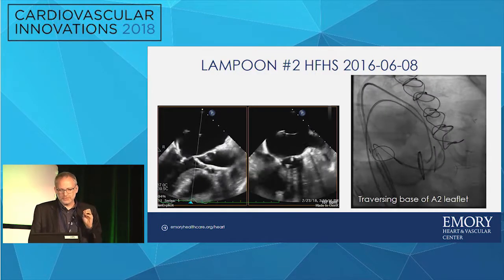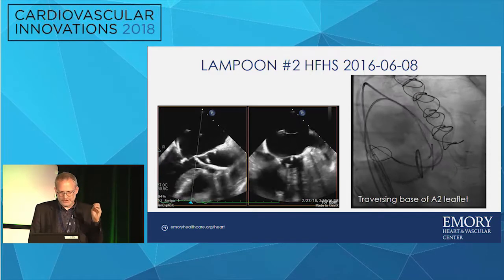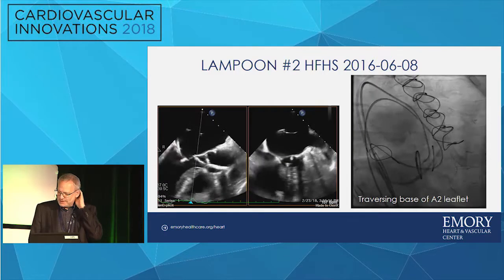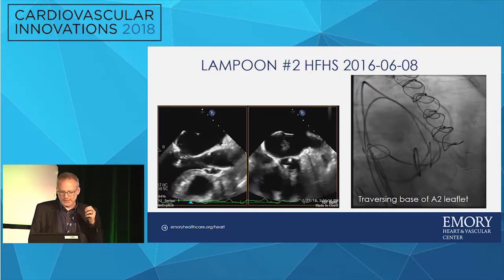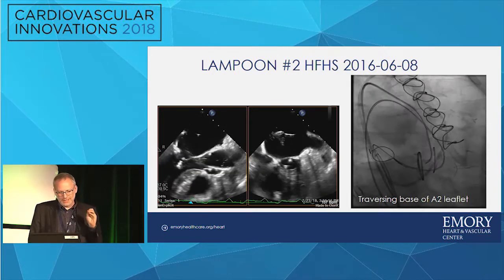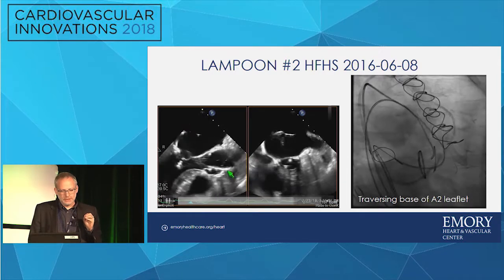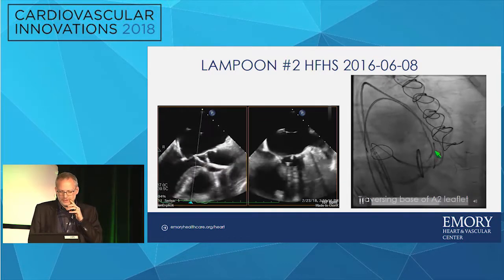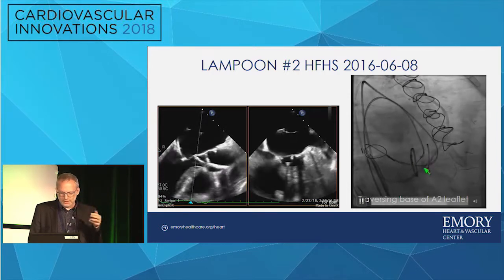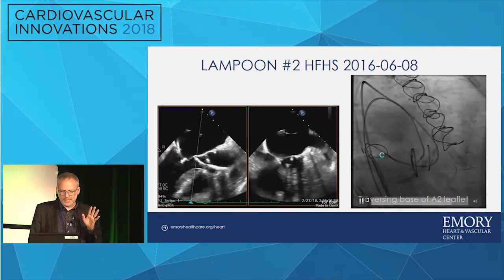So here's the very first case done. I flew down to Emory and my good friend Vasilis, now my partner, and we did the very first one in May of 2016. A couple of days later, my patient was lined up and we came back to Ford. This is the very first case I did at Ford, number two in the world. Here's what it looks like. You just need the LVOT view, and you electrify and burn through. You'll see bubbles in the left atrium. This happened to be a patient with a ring, which is great because you get good landmarks. It doesn't even matter where the snare is. The snare is just to grab it later, okay?